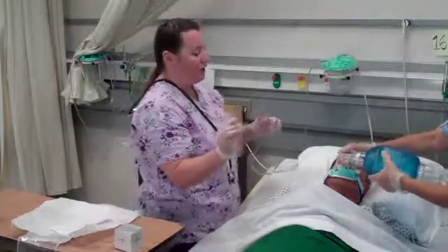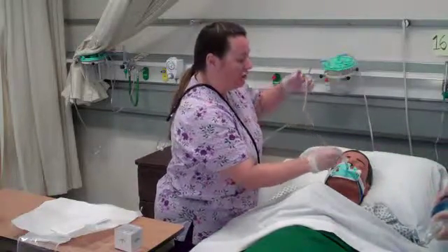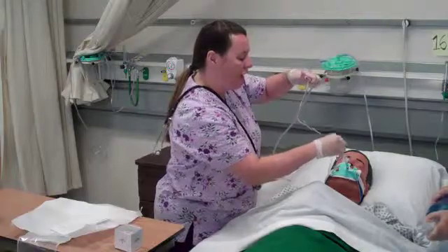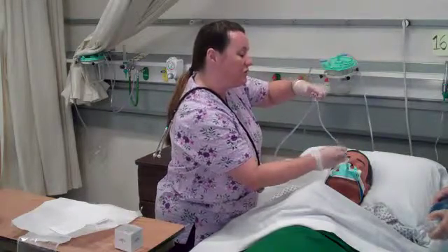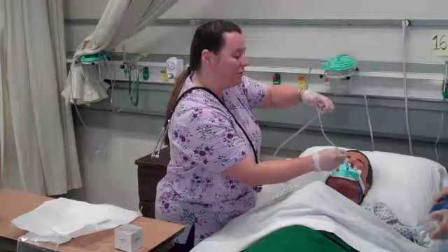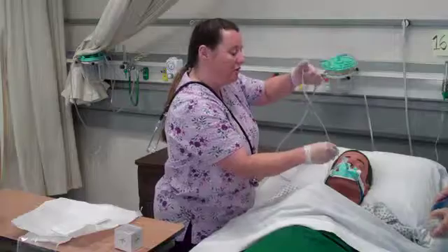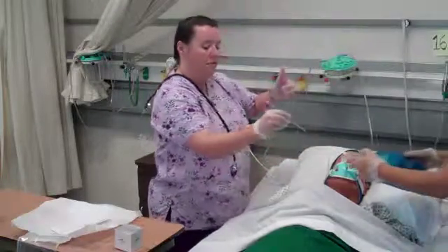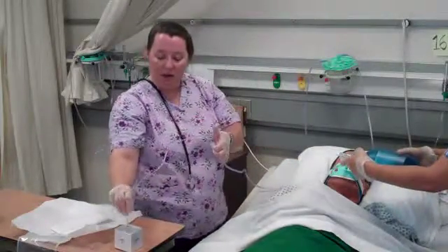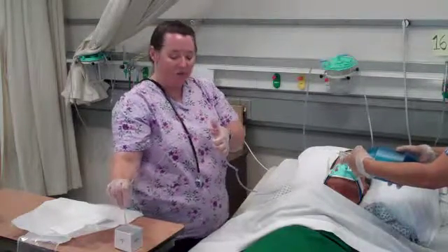And as I go down, I'm going to maintain sterile technique. I'm going to go straight down the ET tube without touching my hand to the tube until I hit resistance or the patient starts to cough. The patient starts to cough, hit resistance, I will pull up 1 centimeter to 2, and I will apply intermittent suction as I come up the tube so I don't hit their internal mucosa. Sterile technique still. I'm going to clear my tubing, and I'm going to reassess my patient.